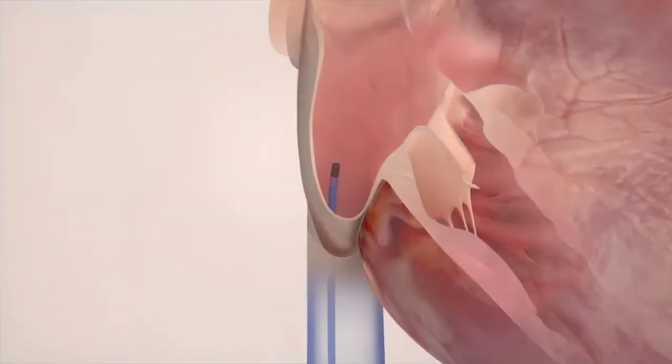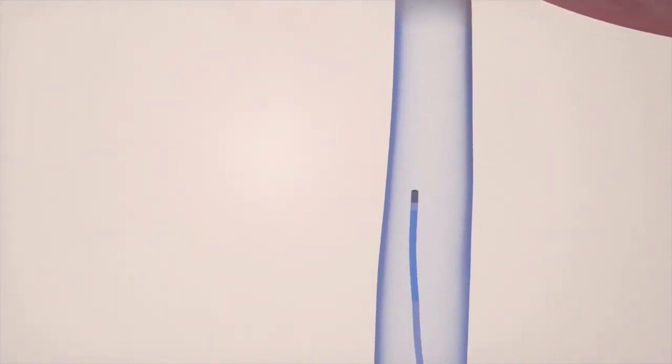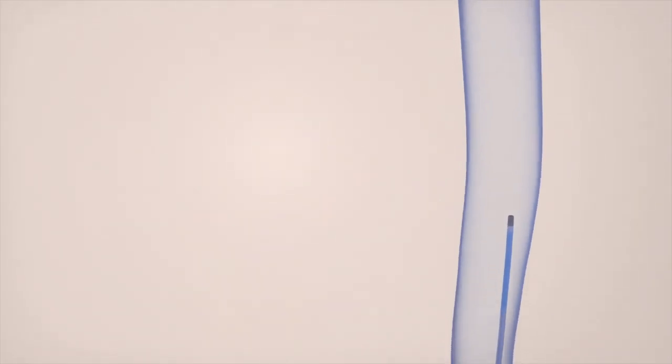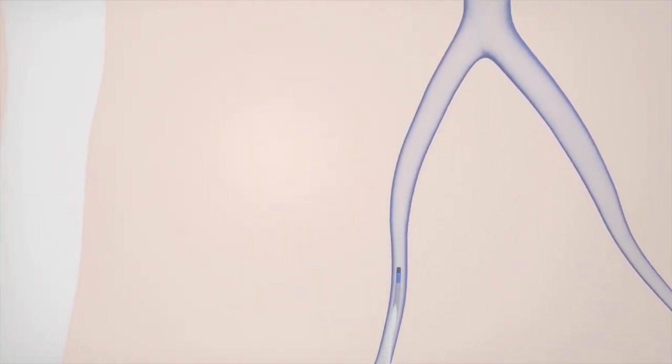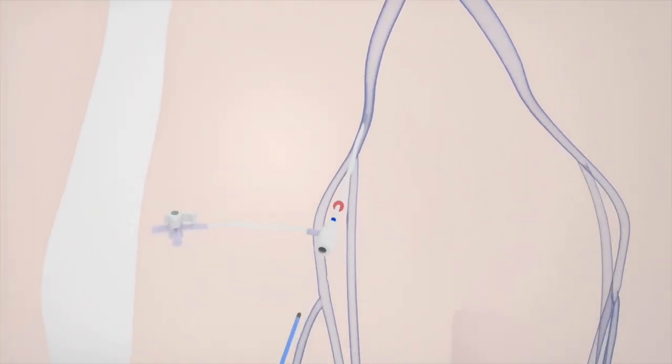The catheter is then removed and a small bandage is applied to the area where it was inserted. Patients are typically out of the hospital in one or two days and can resume normal activities.